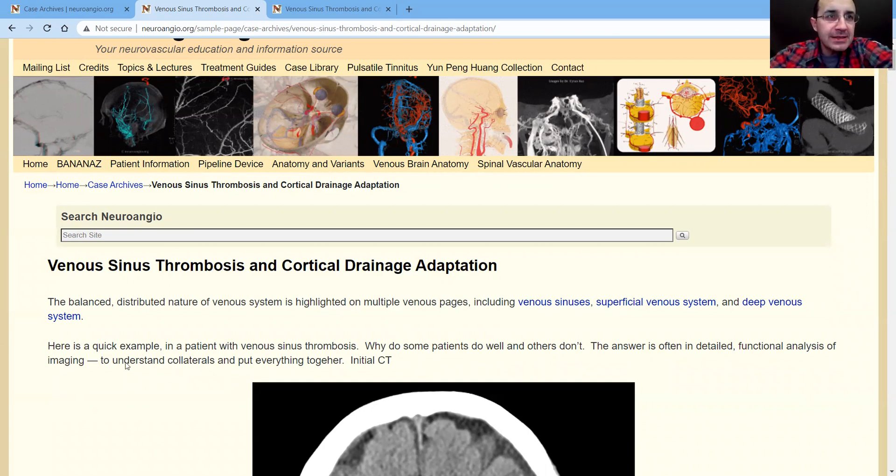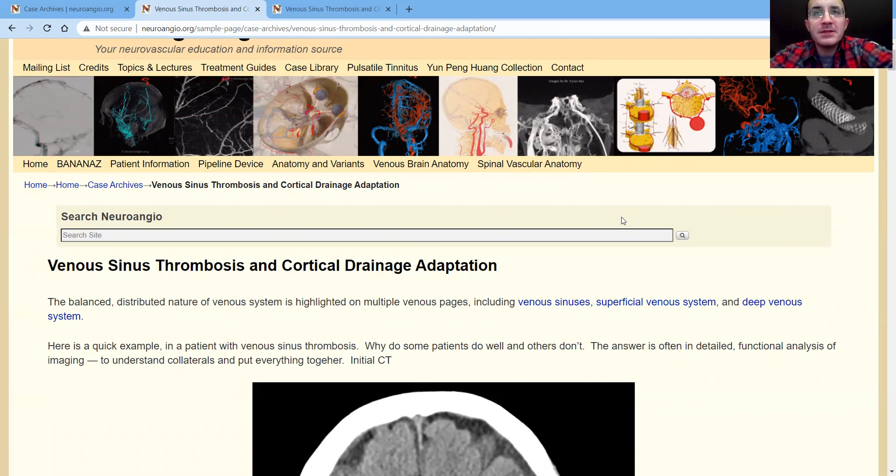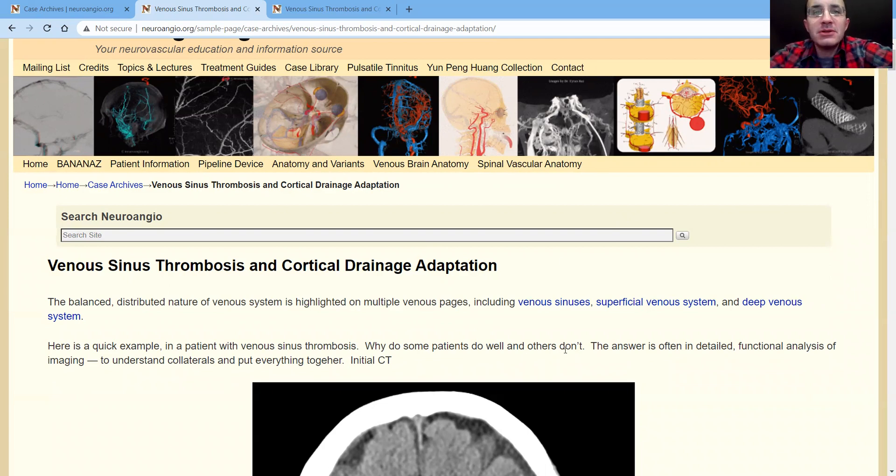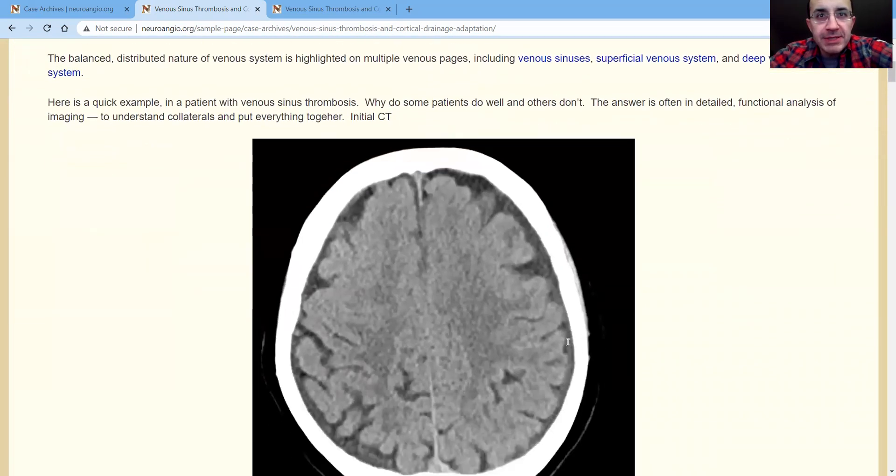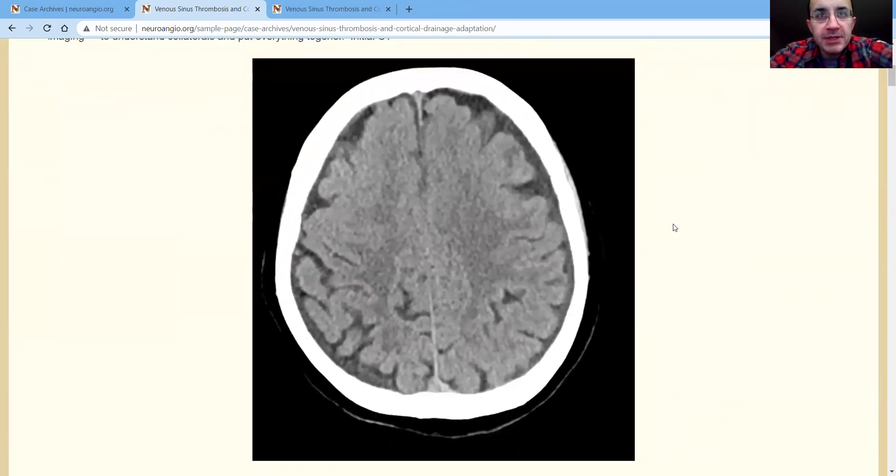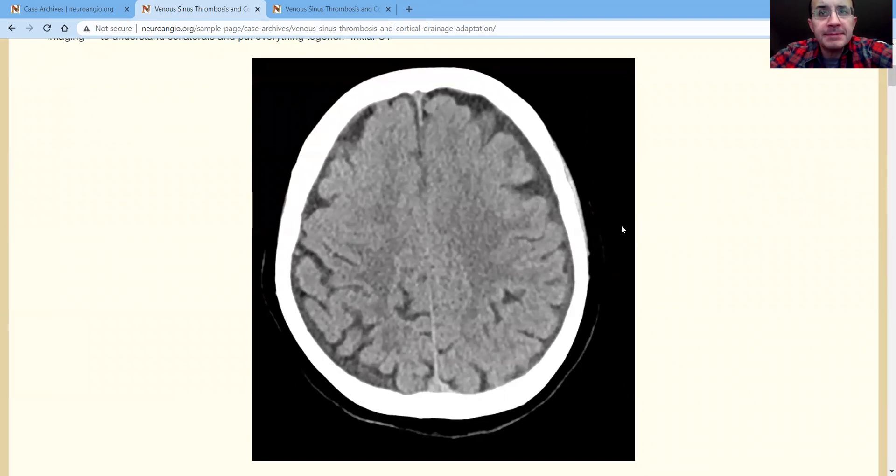So here's the case: venous sinus thrombosis. Patient's doing very well, bad headaches but nothing focal. We have to understand from all of this how to put it all together. Bottom line is a couple of weeks of headaches. Here's a CAT scan. Again, brain is fine.